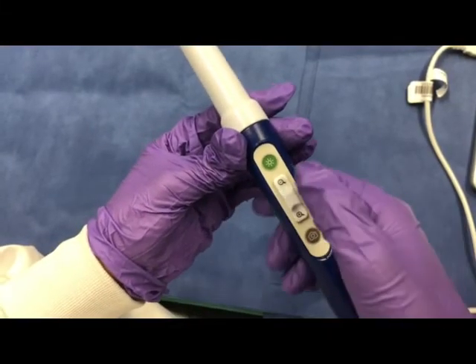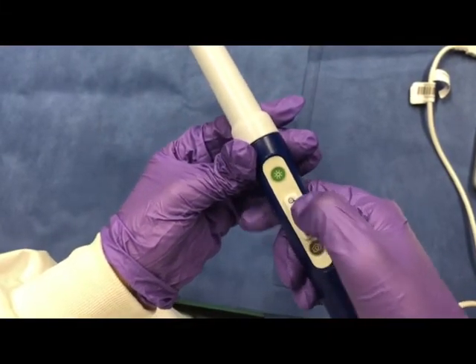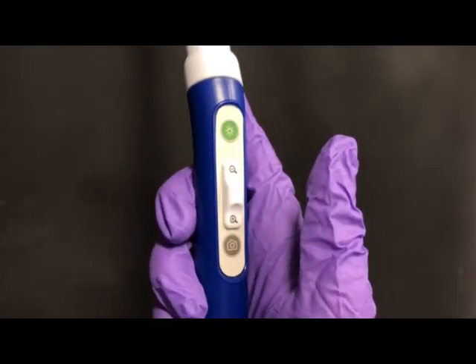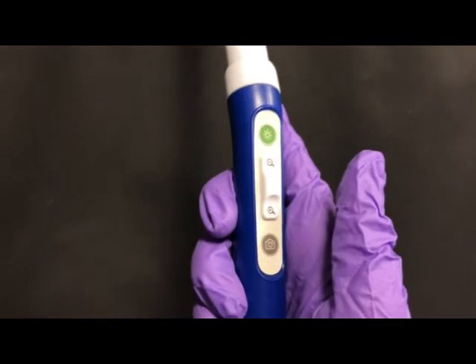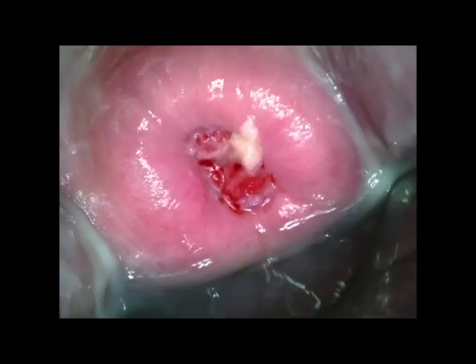Magnifying the image with the focus slider may take some practice. Try moving the focus slider gently, and remember to adjust the position of the pocket colposcope itself in addition to shifting the focus slider. The pocket colposcope is capable of capturing very high quality images, but to do so it must be focused properly. This image was taken using improper focusing technique. But this image of the same cervix was taken by properly using the focus slider and holding the device steady so that the autofocus features could function smoothly.